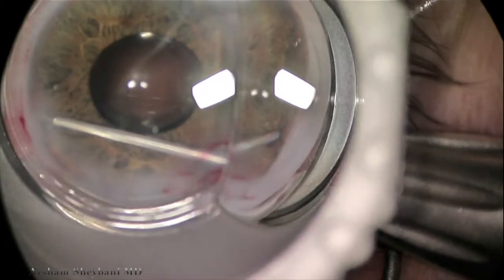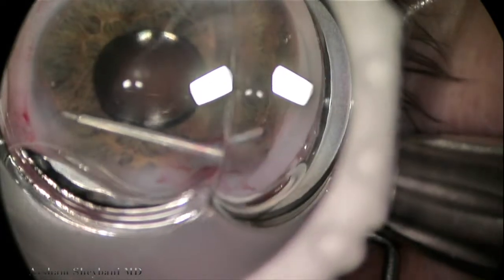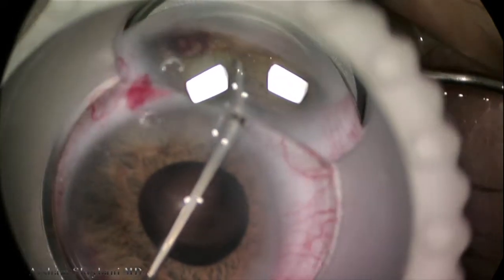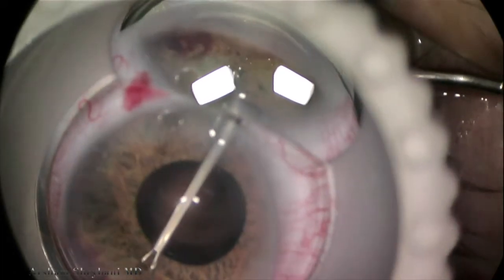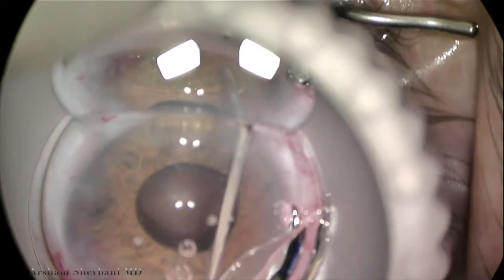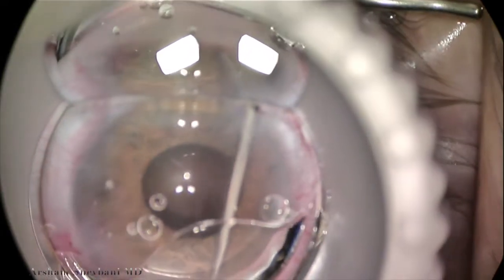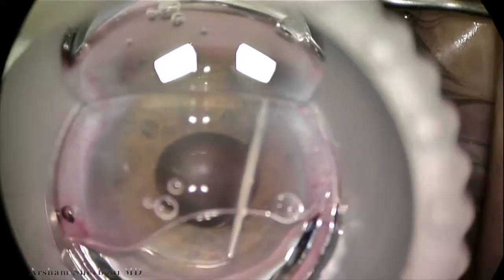We rotate the gonio mirror and continue to release peripheral anterior synechiae. This patient had over 300 degrees of scar tissue — we're now working in another quadrant. The arrow shows where the synechiae still remain. Just to the left, you can see a faint band of trabecular meshwork. As we start to pull, the arrow points to the area where the synechiae will release and a band of trabecular meshwork becomes visible.